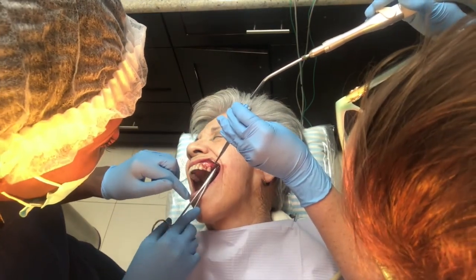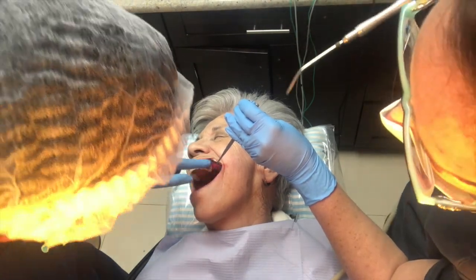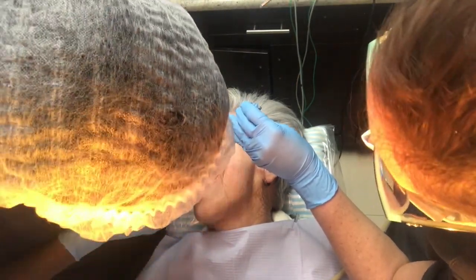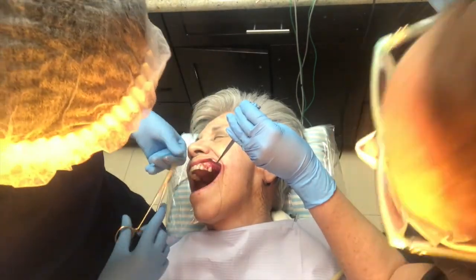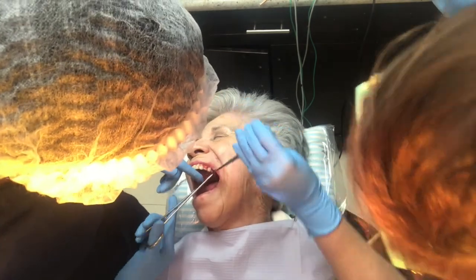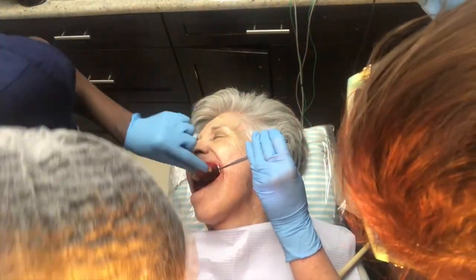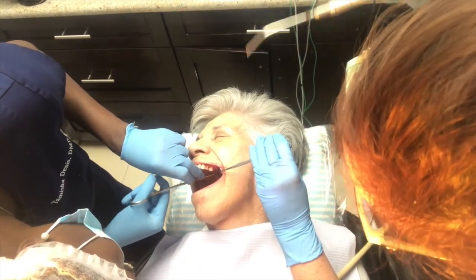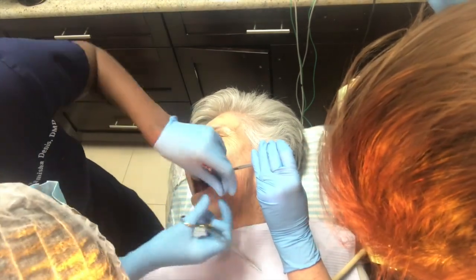So again, I'm putting the sutures in. I tell people the less you do, the better. If you're messing with it, trying to keep it extra clean, that's actually not beneficial. The body is really good at healing wounds in the mouth. So when you have an area that is already stitched closed, your body is going to start to form a blood clot.